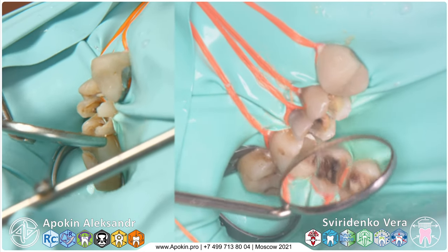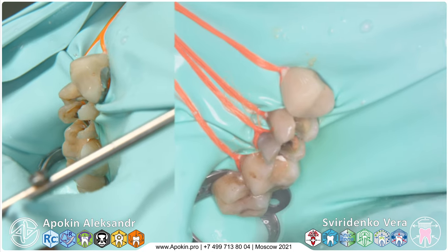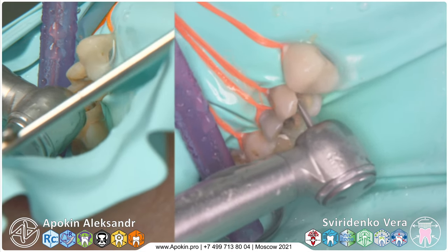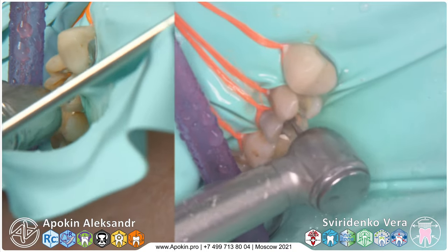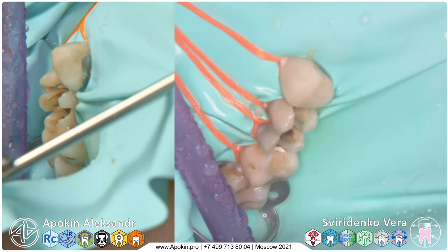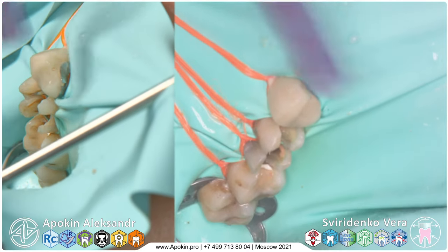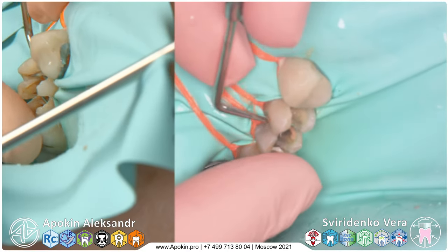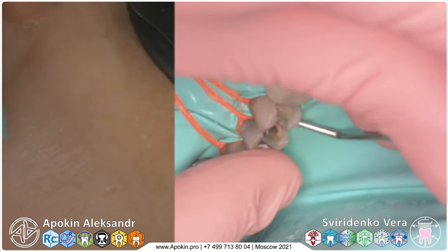We have the two teeth previously treated with the endodontic. We continue to clean the surfaces. We try to reorganize the rubber dam into interdental spaces to insert it some deeper under the edge of preparation in 15.